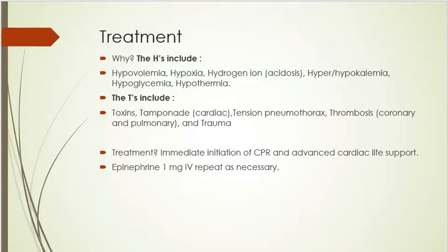Same thing. Call the code. Get the code cart in there. But shocking this patient isn't going to help. You need to give them epinephrine. You're still going to put them on the monitor from the crash cart, right? Hopefully they're on telemetry, and that's why you picked this up. Put them on the monitor from the crash cart, and you will start CPR until everybody gets there. Once you look at the rhythm, you check for a pulse: no pulse, asystole, right? Then the doc is going to ask for some epinephrine.